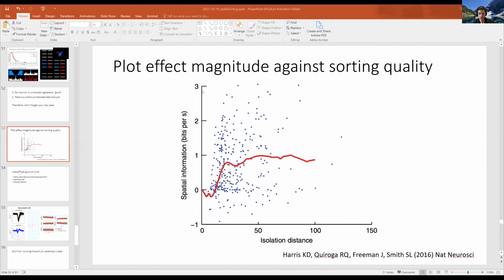And so in this way, you can look at all of your data and take it all into consideration, but also see whether, on the few really, really good neurons, whether that effect is actually disappearing. And that will be a really nice way to combine in a thoughtful way your quality metrics without having to draw a hard threshold, combine your quality metrics with your analysis conclusions. So I think this is a really good approach when possible, and you should keep it in mind.